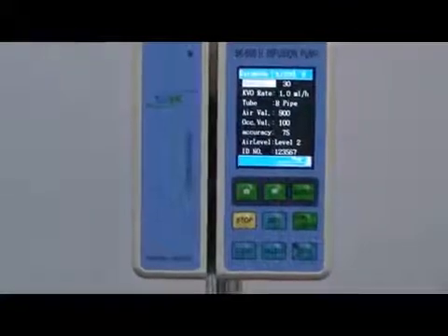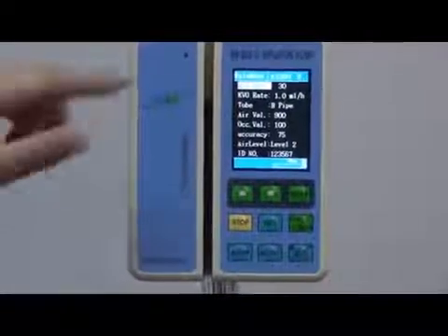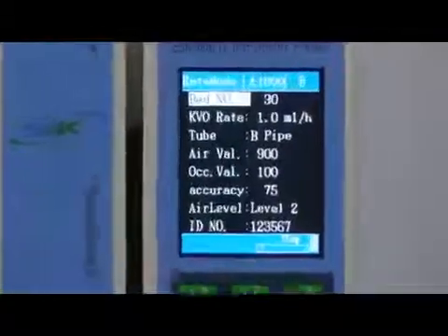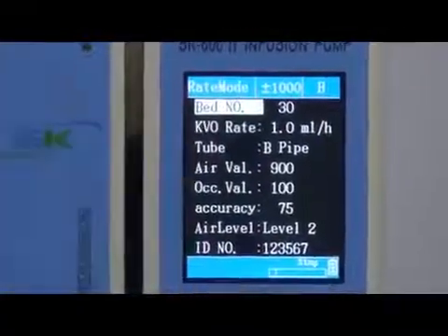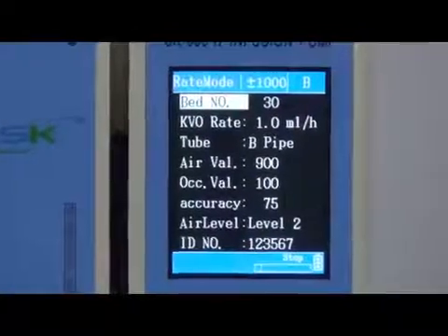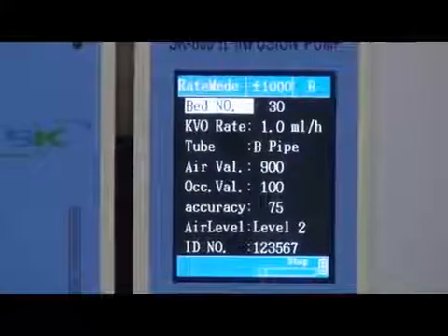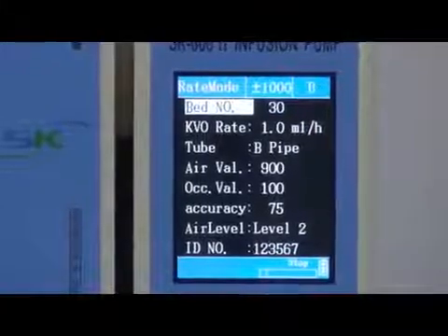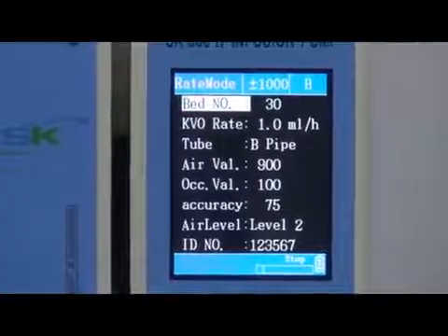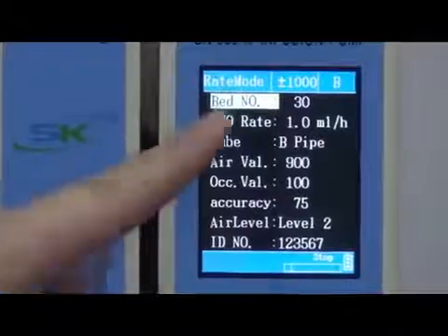In this interface, there are more parameters to understand. The first one is bed number. If you want to use the pump alone, there is no need to set the bed number. But SK Medical also has a station — with wireless networking, all the infusion pump information can be transferred to the nurse's station. If you want to use the pump together with the station, it is very necessary to set the bed number.